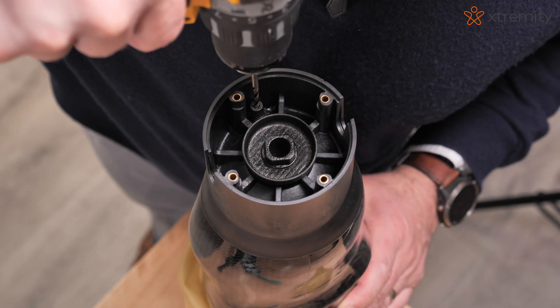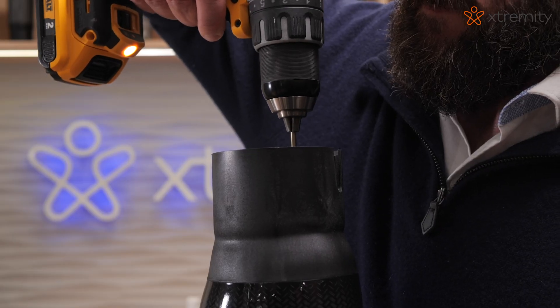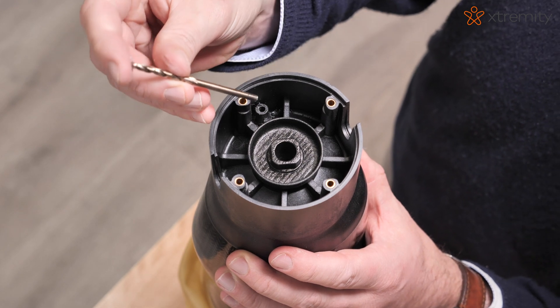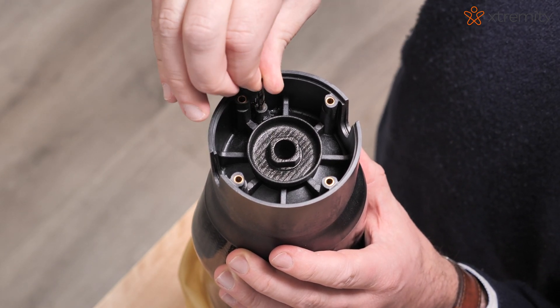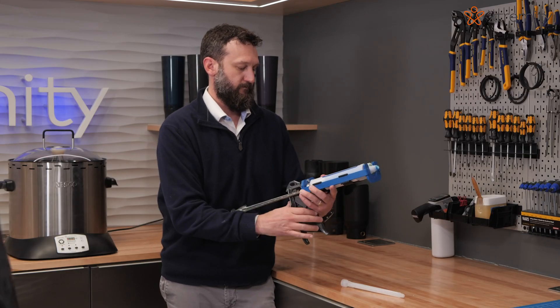If using vacuum suspension, using a 5/32-inch drill bit, drill a hole through the base vacuum port. Remove the bit from the drill and place the smooth end of the drill bit into the hole you just drilled to seal it. This will create a vacuum channel through the distal end pad. If using suction, skip this step.